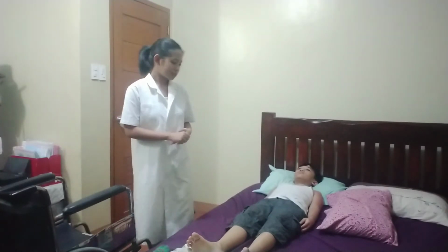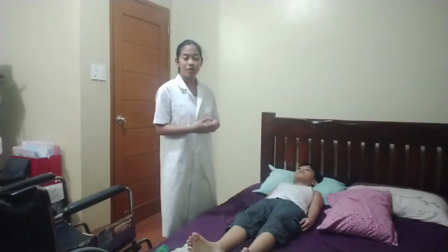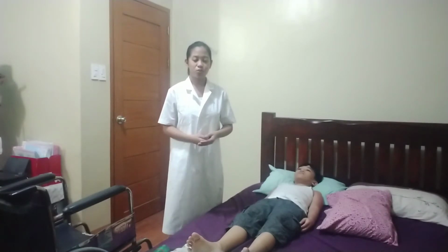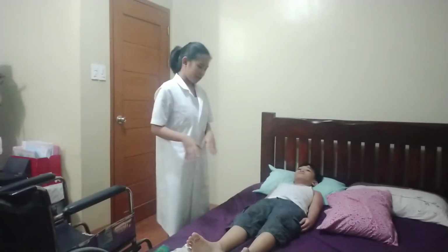And then after that, I will lower the rails of the bed and stand near the patient's hip with my feet spread at shoulder width and one foot slightly in front of the other. And then I will encourage my patient again to use the stand assist device if it is available and assist my patient to sit up in the side of the bed. So I will ask my patient to swing his legs over the side of the bed later.